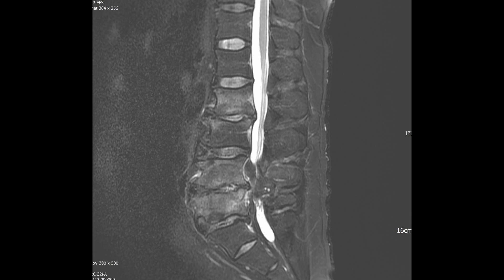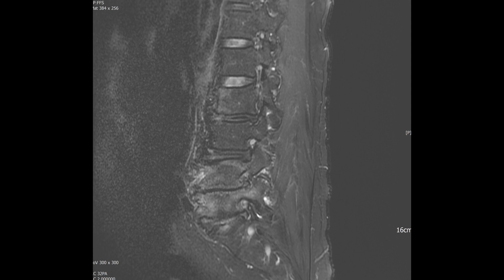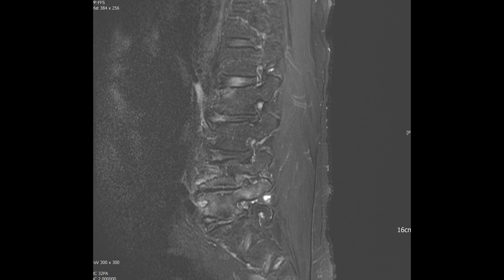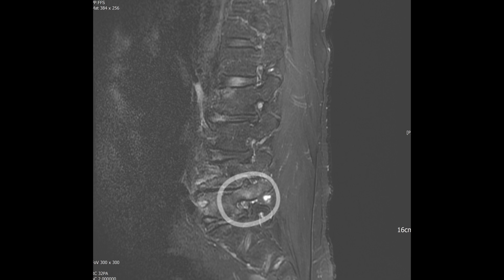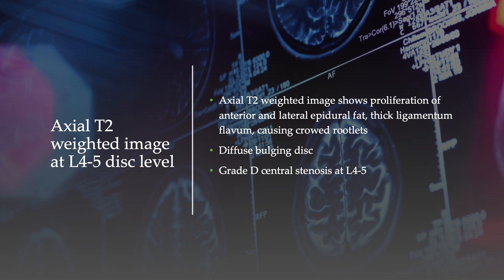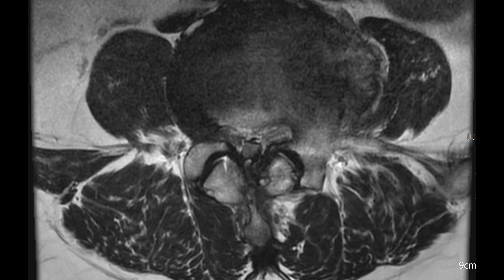Additionally, there's notable high signal intensity within the L4-5 and L5-S1 discs. Another key observation is the pronounced proliferation of fat within the anterior epidural space, spanning from the L4 body level down to the S1 level, leading to a narrowed thecal sac. The left perisagittal and far lateral images further unveil high signal intensity within the bone marrow of L4 and L5 bodies and the L5 pedicle. Significant foraminal stenosis at L4-5 and moderate foraminal stenosis at L5-S1 are evident. Upon reviewing the axial T2-weighted image at the L4-5 disc level, there is an increase in both anterior and lateral epidural fat. Combined with a thickened ligamentum flavum, it results in crowded nerve rootlets. Additionally, there's observable diffuse disc bulging and grade D severe central stenosis at the L4-5 level.